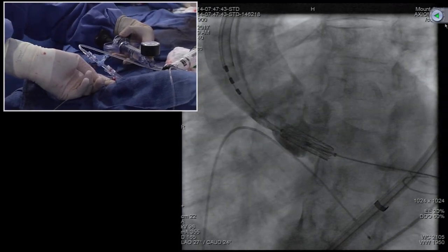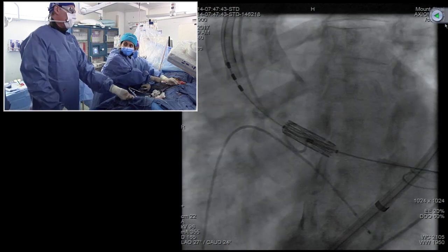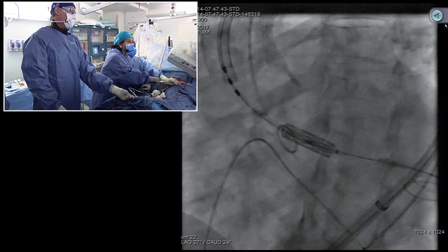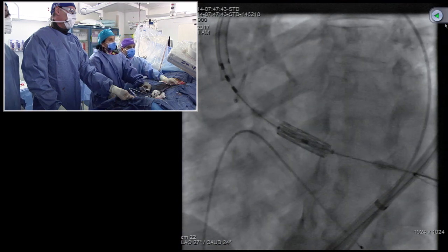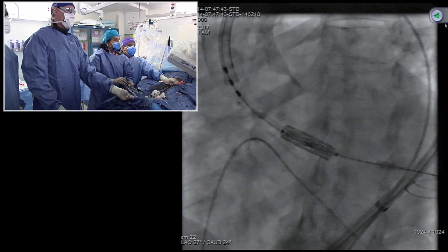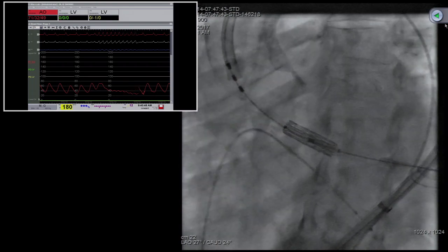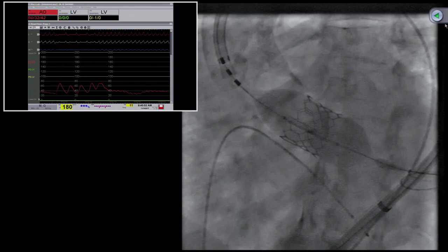Now, everybody agrees? Because these are the one or two steps which we use before we go on final. Many times people do a partial inflation, then injection. So 180, you have made it. We need a little blood pressure push also. Not yet. We are pacing, and as soon as we are done inflating, that's the time you go up.